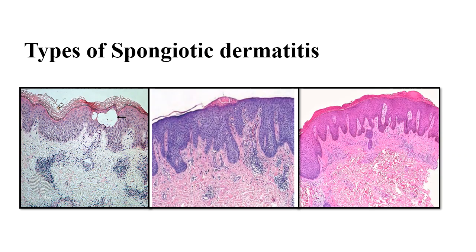Now here are the pictures. We can see acute spongiotic dermatitis with intraepidermal vesiculation. In subacute, we can see moderately acanthotic epidermis. There is parakeratosis and crust formation, whereas in chronic, we see hyperkeratosis, parakeratosis, wedge-shaped hypergranulosis, marked acanthosis, but sparse inflammation. Also, we see papillary dermal fibrosis.